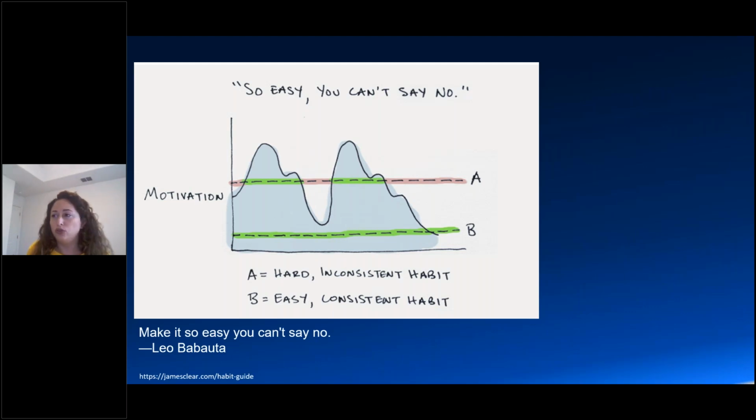We don't want to look at a scan the first day from your living room when you're remoting into your office, the second day in your practice office, the third day at the acquisition PC. You're just confusing your mind more. And this doesn't mean that this is the way it has to be forever, but in the beginning, before you create a system, these are the things we need to do.